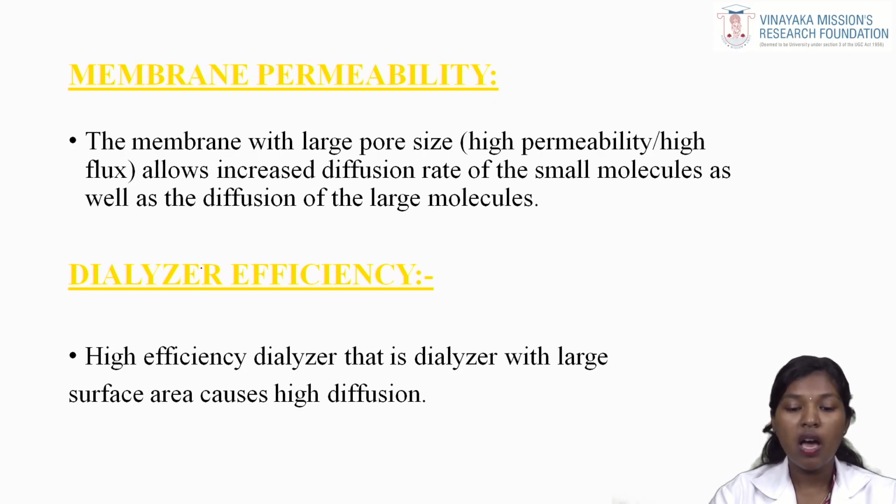Dialyser efficiency. A high efficiency dialyser, that is a dialyser with a large surface area, causes high diffusion. High efficiency means a large surface area dialyser has high efficiency. So here the clearance also increased, and the clearance is also good and better.